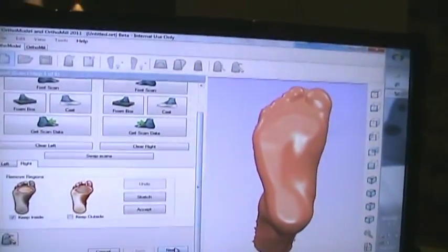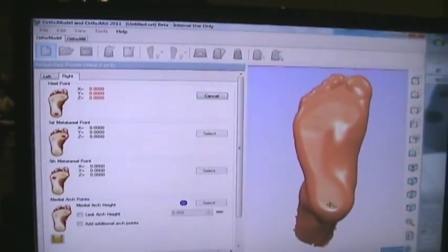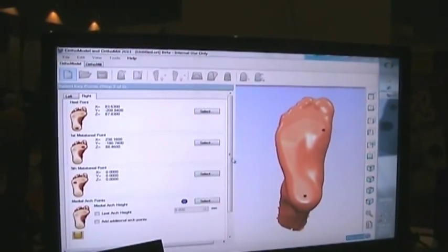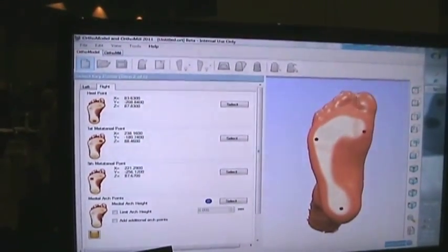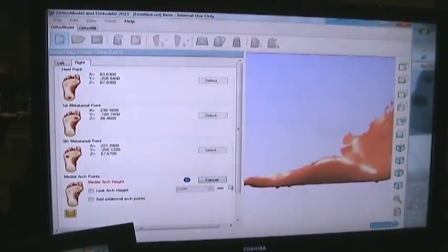Next, we're going to position and align this foot so OrthoModel can design an orthotic based on this foot shape. To do that, I'm going to place the center of the first metatarsal head, the center of the heel point, and the center of the fifth metatarsal head. These three points are going to align the foot to the ground, and the software is going to start getting the measurements to design the orthotic.